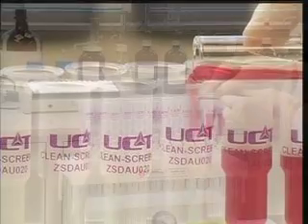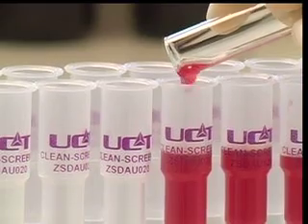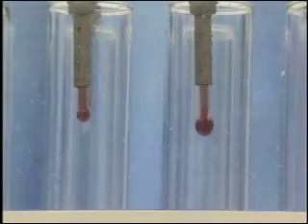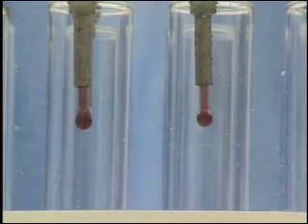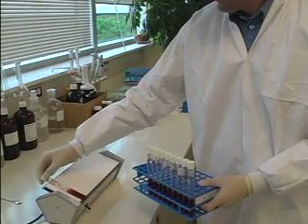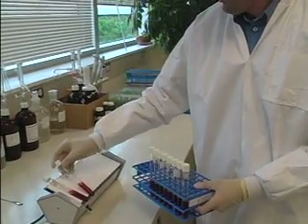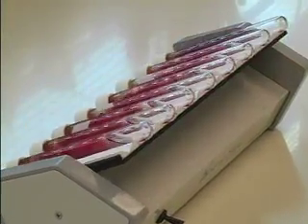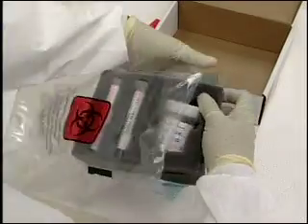The services performed by the toxicology section of the Division of Forensic Sciences are some of the most sought-after tests provided by the crime lab. Toxicology specializes in the testing of blood, urine, and other biological specimens for alcohol, drugs, carbon monoxide, poisons, and volatiles. Toxicology tests are performed on suspected DUI cases and for post-mortem death investigations.